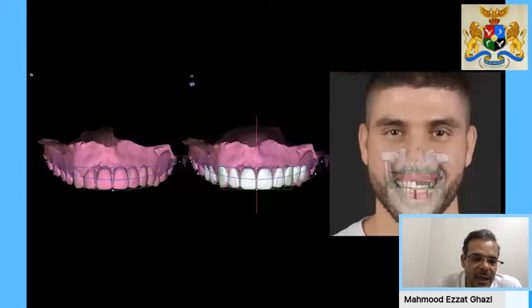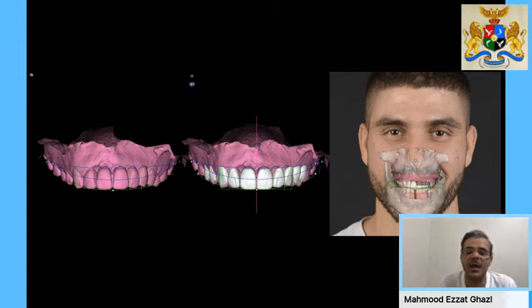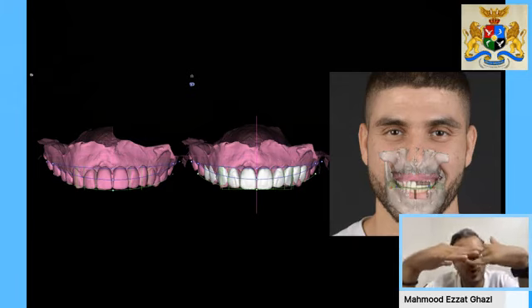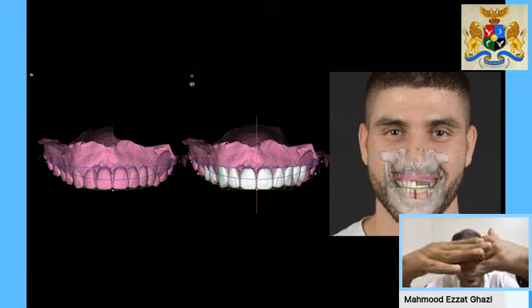Now you can see from the plan here, the teeth, of course, were too long. This is our new gingival margin. The new gingival margin here needs to be above the patient's upper lip, because we're going to, of course, use a hybrid prosthesis in this area. It will be impossible to regenerate using the studies that we had showed you.